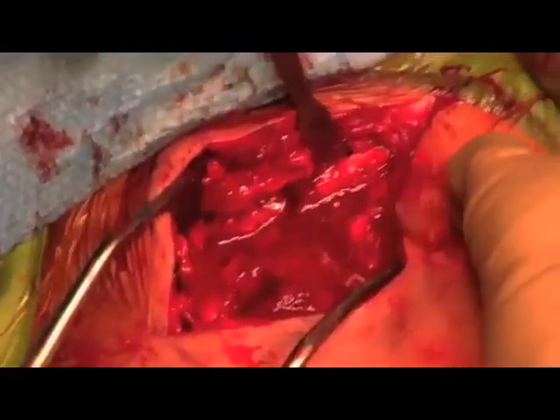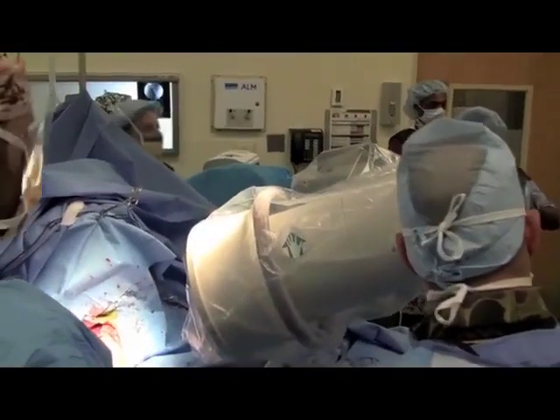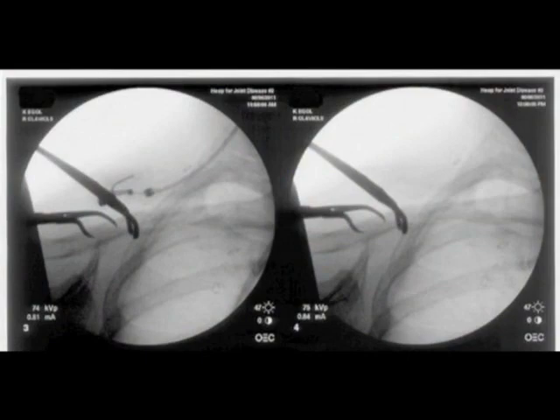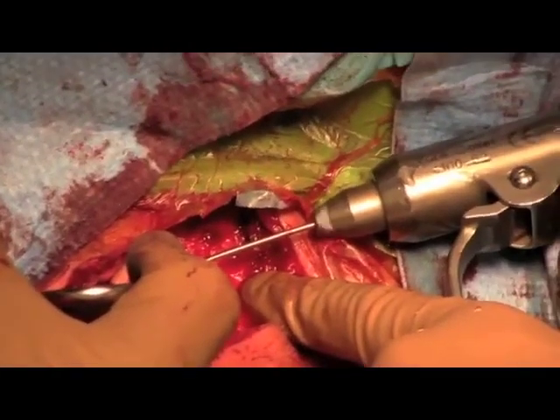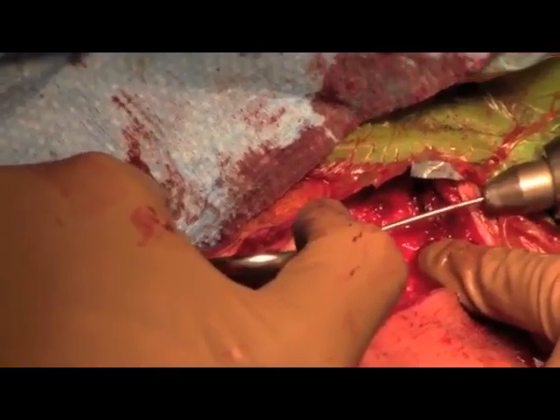The medial and lateral fragments are identified, and a provisional reduction is obtained with the use of clamps and arm traction. Reduction is confirmed radiographically. A K-wire may be placed to hold the reduction and allow for clamp removal and subsequent superior plate placement.